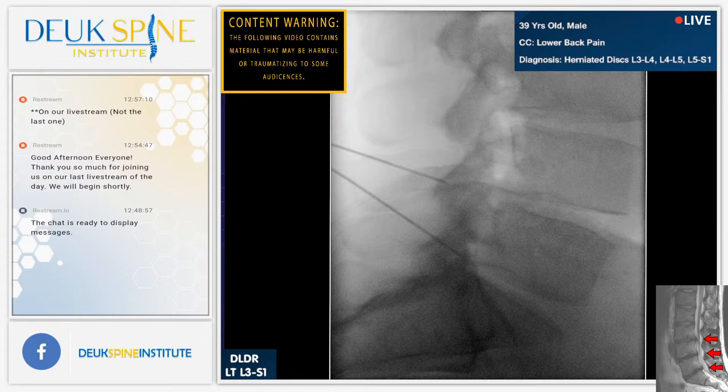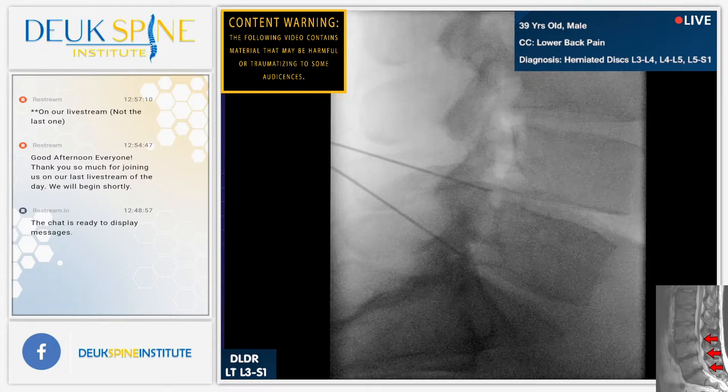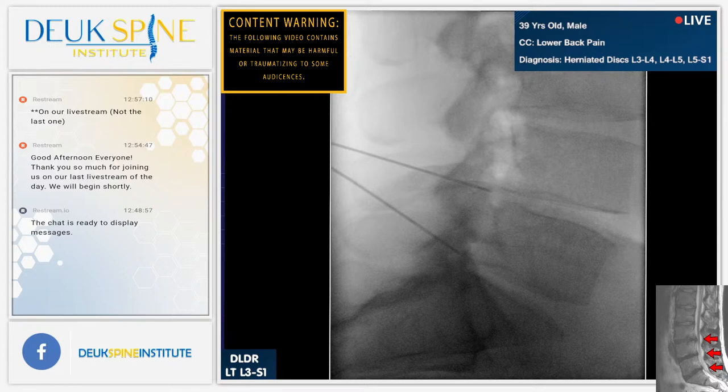We have almost no bleeding, very small amount. Shot. When I say shot, what I'm telling my team is get an x-ray picture. Shot. We use the x-rays to guide us. Shot. All right, looks good. I feel really comfortable with that one. That looks good. We've got one more to go.